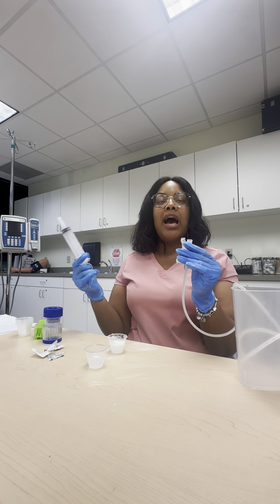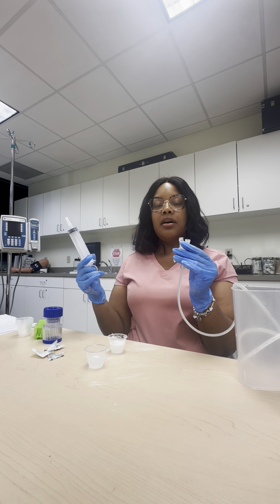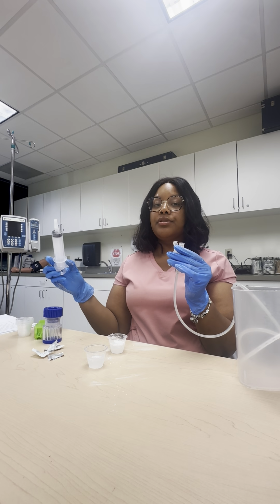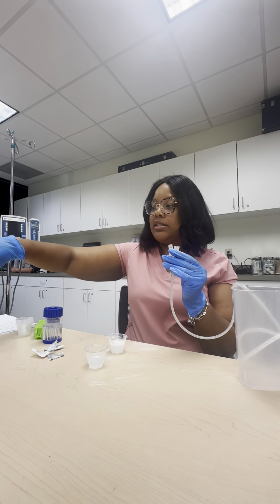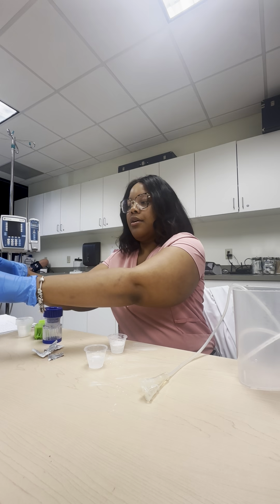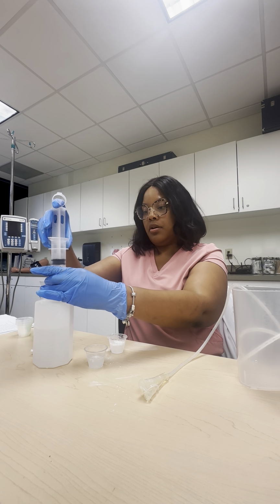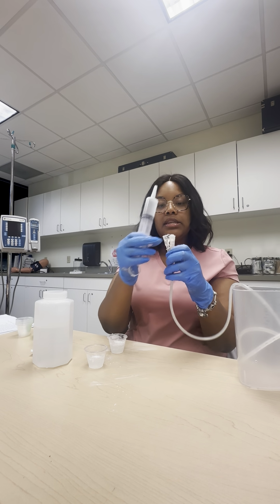Another thing is, I always like to flush with force. Force means by the plunger. So how much do we have to flush with first before giving medications? 30 ml, so 30 cc's. So we're going to pull up 30. We can put our cap on this, set this down, and then come over here and pull up the 30. All right, so we got our 30 cc's.